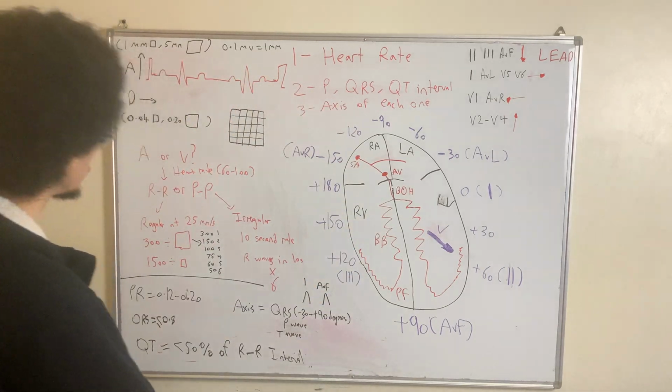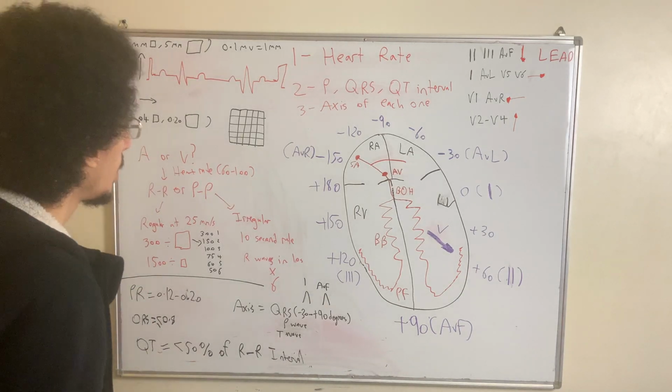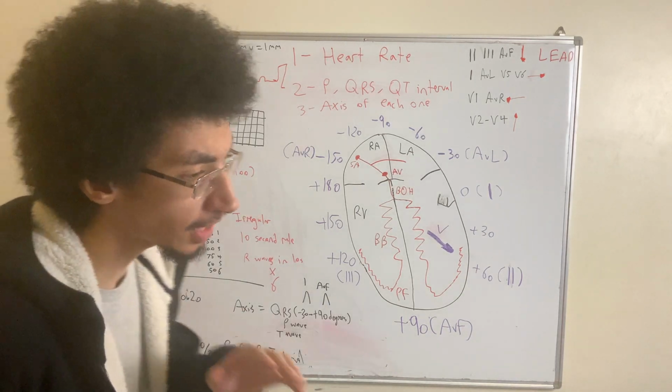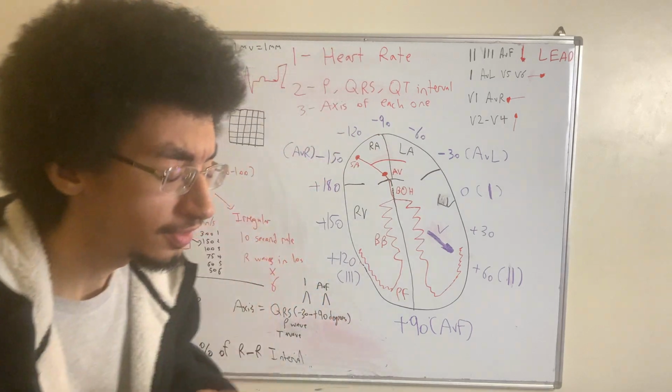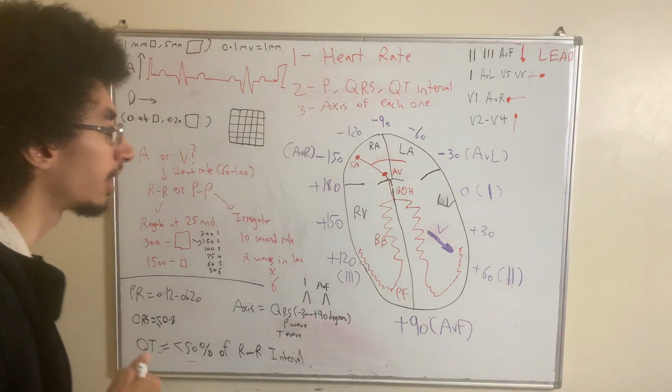So now that we've got that out of the way, let's talk practically about how to calculate the heart rate.